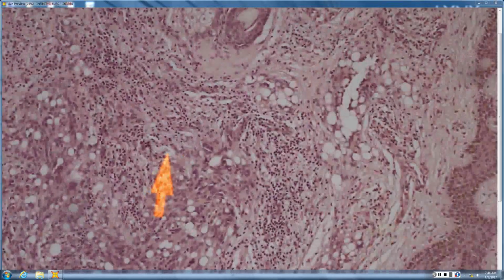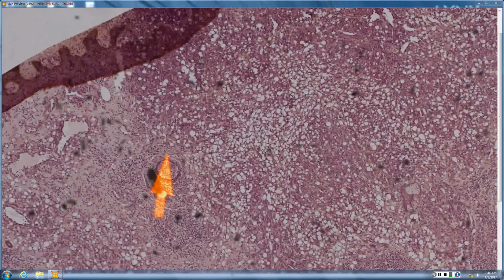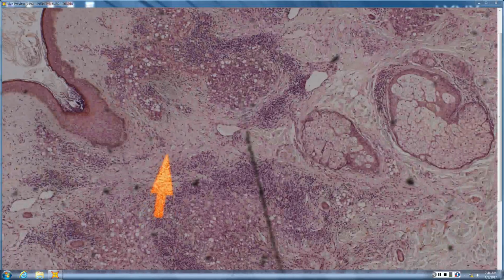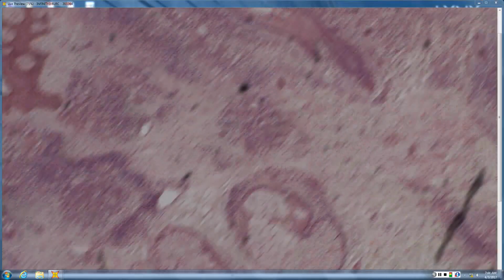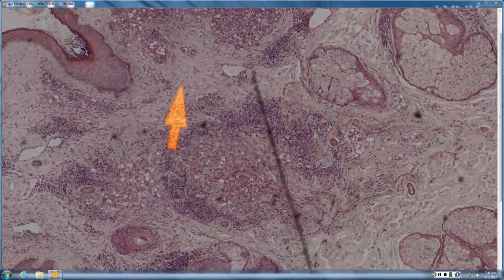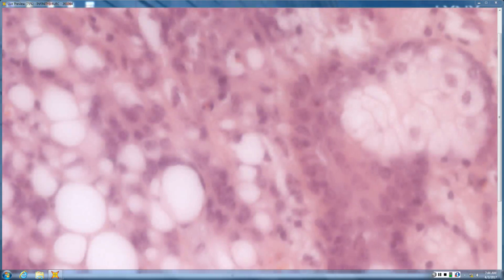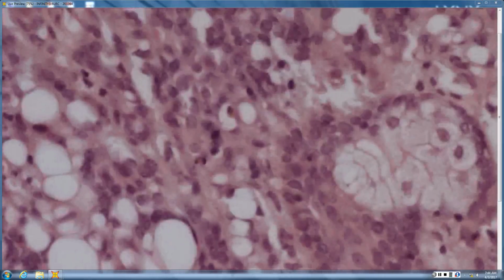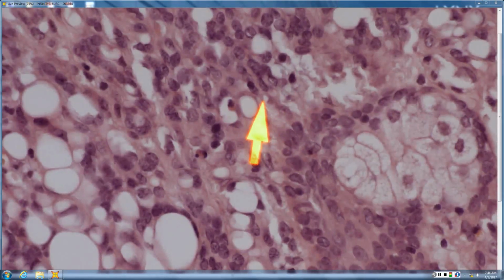So definitely some lymphocytic infiltration. It almost kind of looks like honeycombing of the dermis, but that's just more vacuolization. So the whole thing is nodular and diffuse in growth pattern, right? So you have nodules and you have diffuse areas. And you commented on honeycombing, I think you're talking about all those little round spaces, which are little intracytoplasmic lumens. So you have a million little intracytoplasmic lumens.